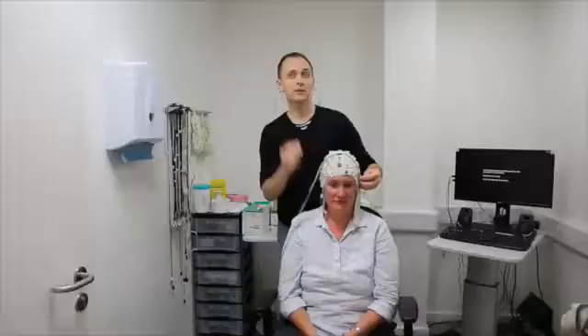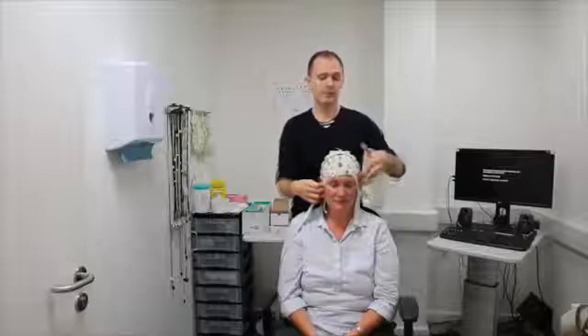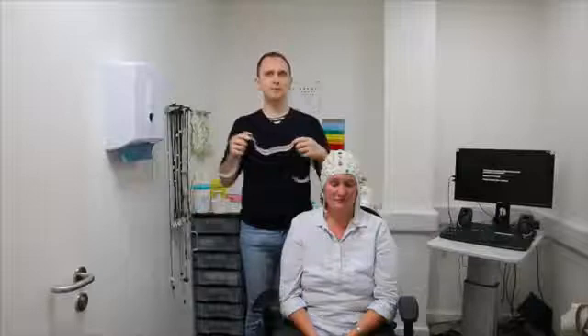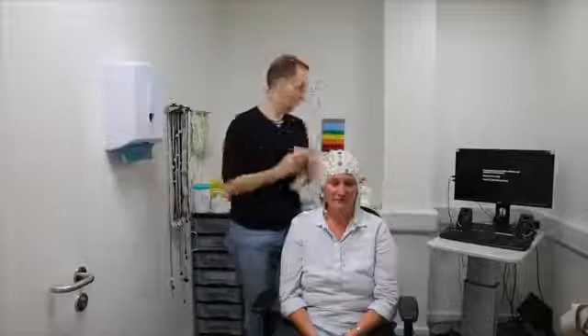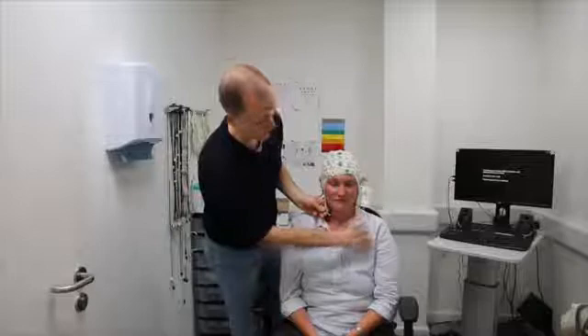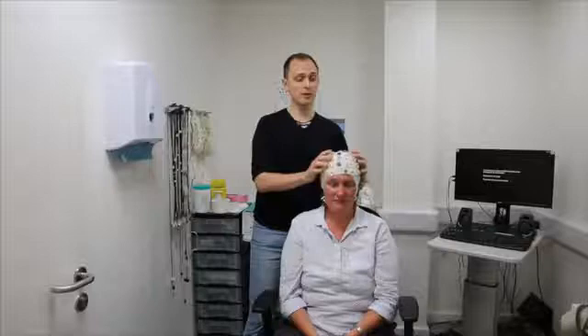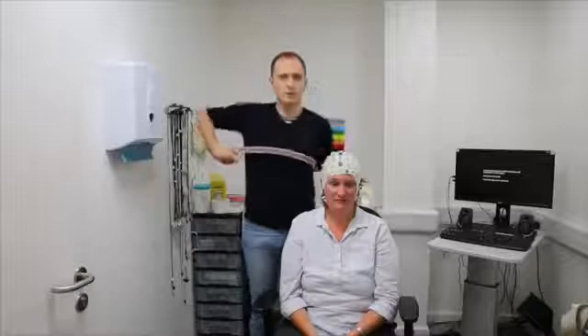To line up the cap in the other direction, measure between the two tragus points — the little point that sticks out on each ear. That distance for Lisa is about 34 centimeters, so CZ should be at about 17 centimeters right in the middle. We've got a well-positioned cap. To secure it, I'll use a chest strap, though one option is a chin strap that's already part of the cap — simply velcro it under the person's chin, making sure the cap is still flat. If securing the cap moves it, re-measure to make sure the position is correct.